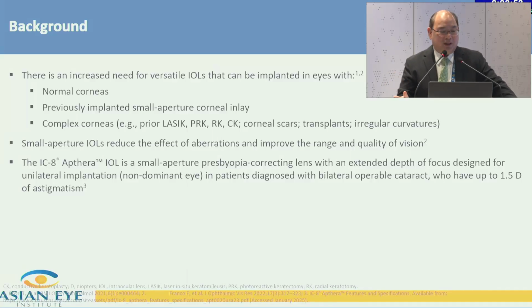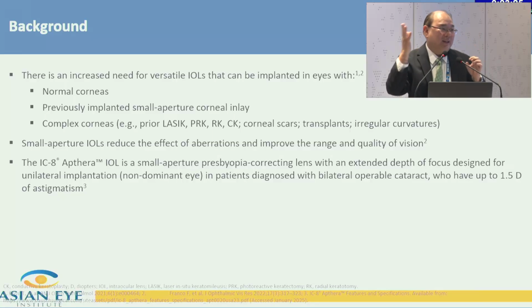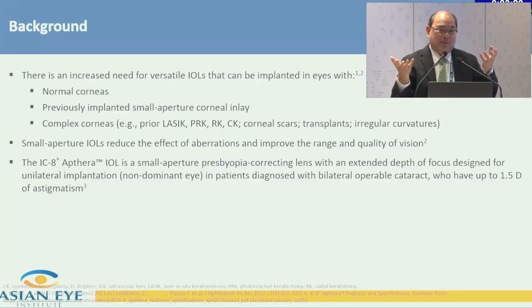So what do we do with these patients? These patients have corneal aberration. Dr. Becker's population is those with compromise in the posterior segment, such as the retina and glaucoma. This one is compromise in the cornea. Those are two different usages for two different populations. We cannot use the pinhole on a compromised retina, because if the defect is in the center, it's no use. Whereas you cannot use the segmental design if there's a compromised cornea, because you will get more aberration. So it's two different target populations.